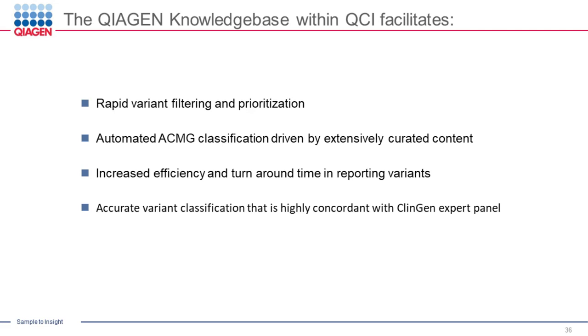So let's get started. Our first question, Dr. Poitras, is how frequently is the knowledge base updated? Okay, that's a great question. As I mentioned, we have several sources of content. The content in the literature is updated basically daily, or we like to say on a weekly basis, so we're constantly updating that. Anything that we're getting from a database such as ClinVar and HGMD or OMIM, for example, those are all updated on a quarterly basis.